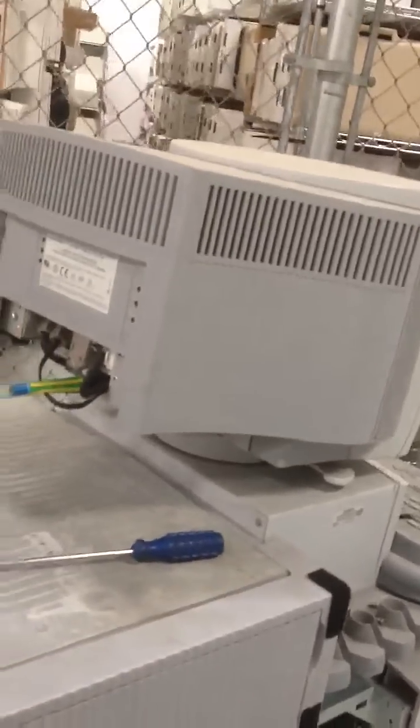Hi Ken, this is how you will replace the internal Ethernet cable of the ultrasound machine.